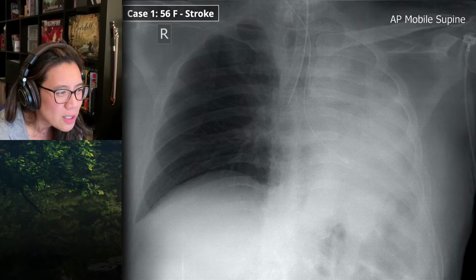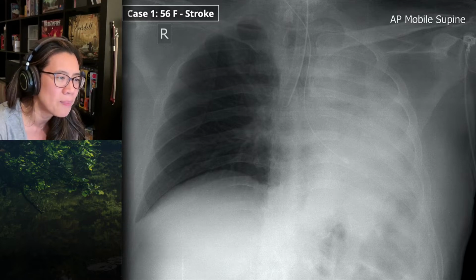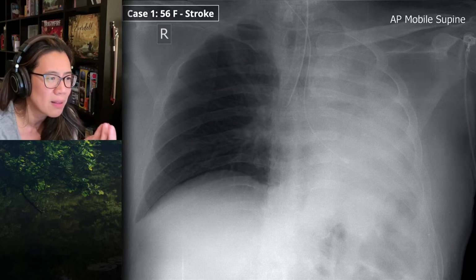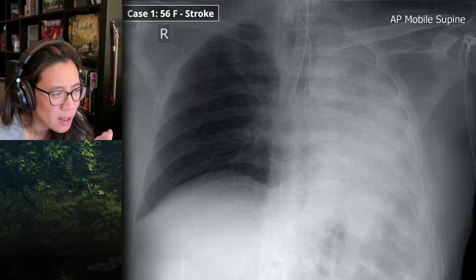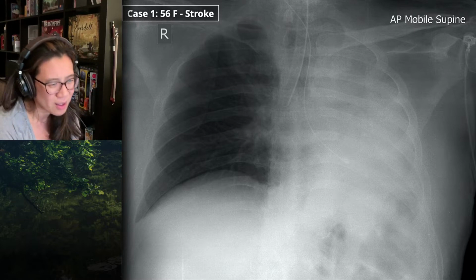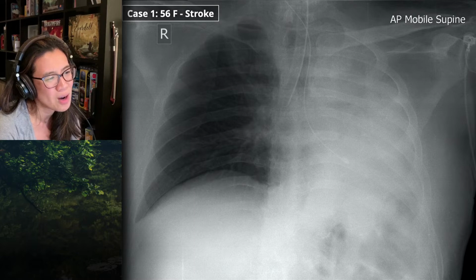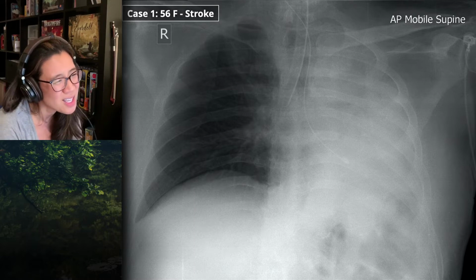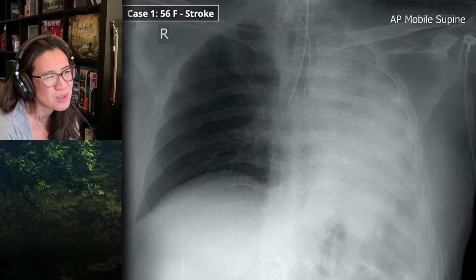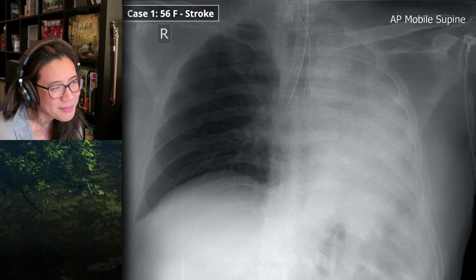If I trace it, the issue would be that if there's volume loss and if there's shift of the esophagus and the stomach, then could it be in the stomach? So I'm looking for the stomach bubble, which I don't think I can confidently identify. And that would be a good location for the left lower lobe bronchus. So I would say 80% certain that it's in the left lower lobe bronchus. Right. Well, it looks like it's in the left lower lobe bronchus. But why don't you look at its course?